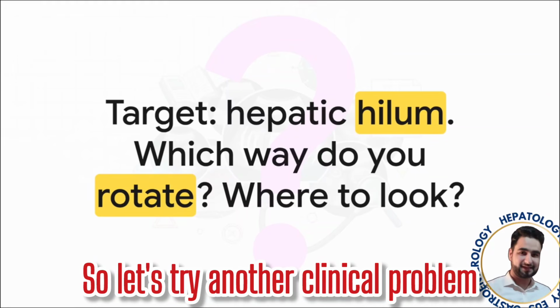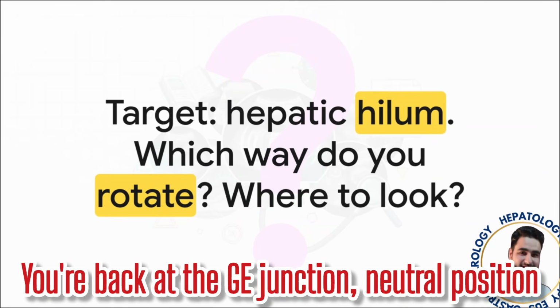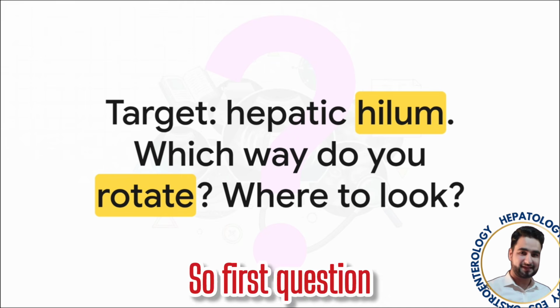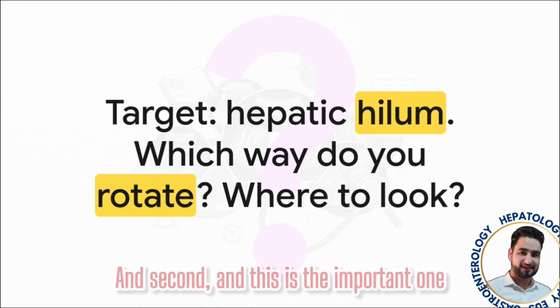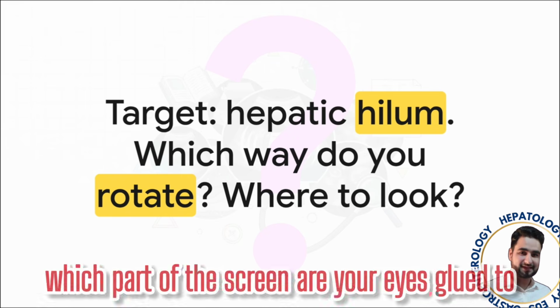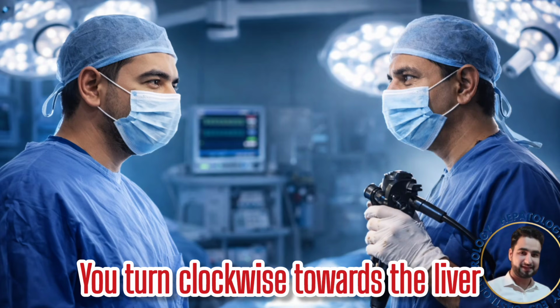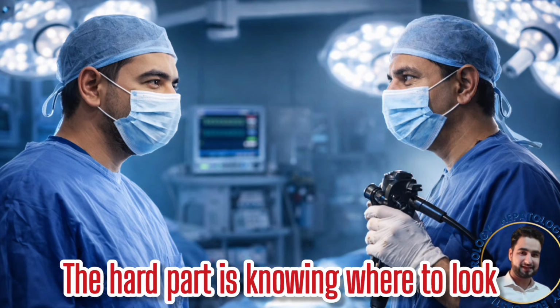So let's try another clinical problem. You're back at the GE junction, neutral position. You need to find the hepatic hilum. So first question, which way are you going to rotate the scope? And second, and this is the important one, which part of the screen are your eyes glued to? Here it is. This is the aha moment. The rotation is the easy part. You turn clockwise towards the liver. The hard part is knowing where to look.